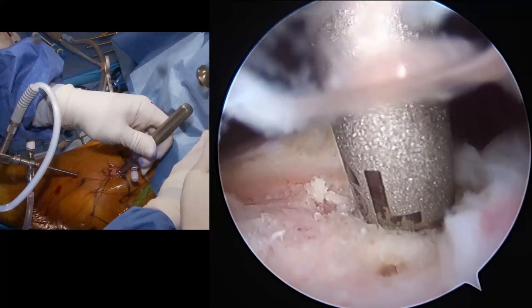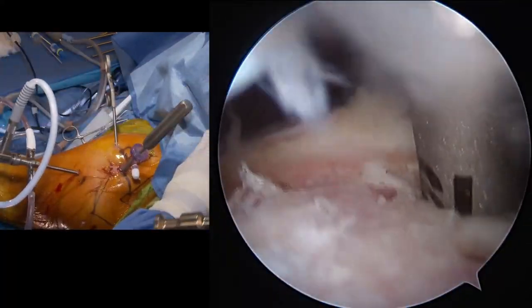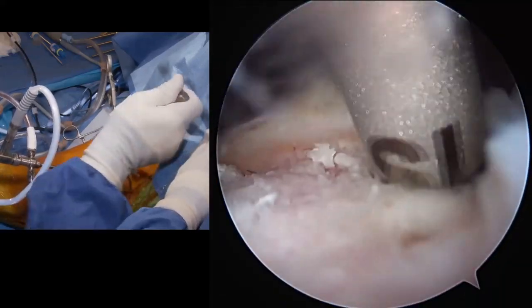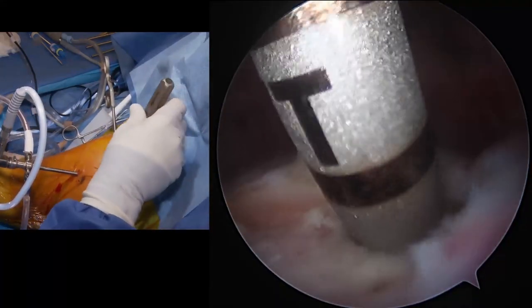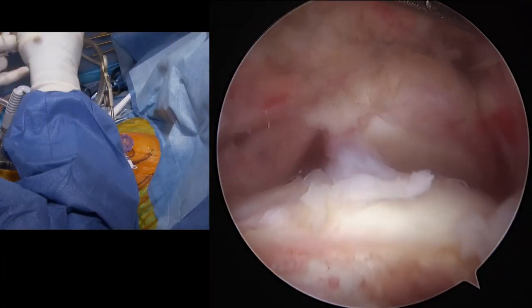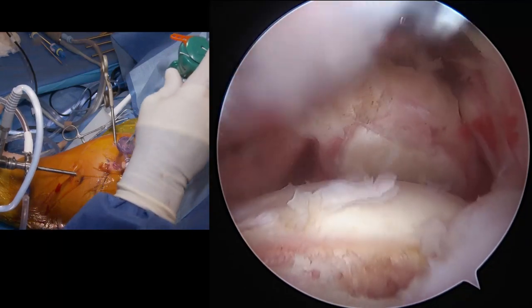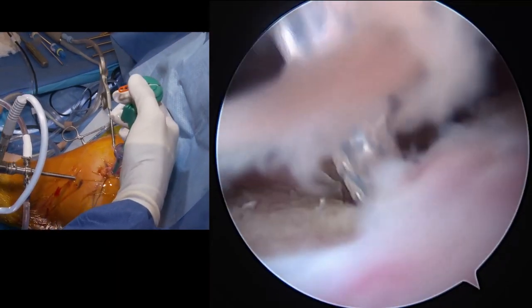Keep going all the way down. It's got to be buried. Okay, a little more. Okay, good. Stop. Take it down. So there's two. There's an older anchor, which is the FL, and then the swivel lock is the SL. So we take it down to the SL line so that that'll be seated properly.